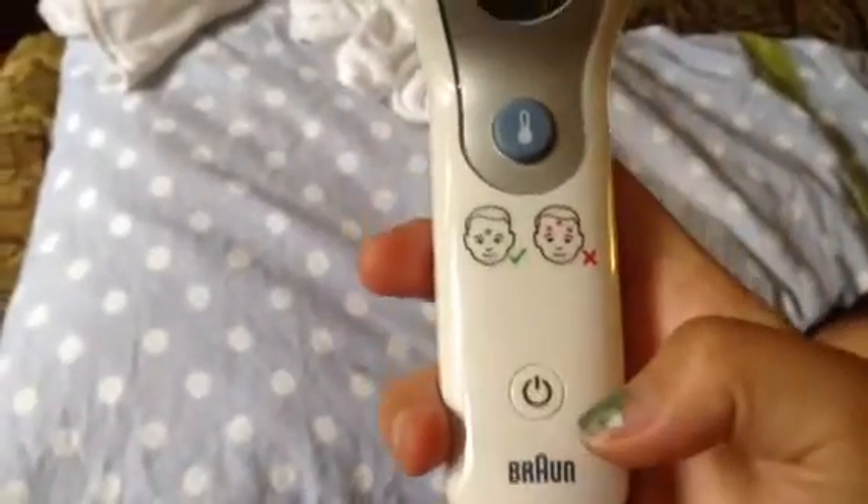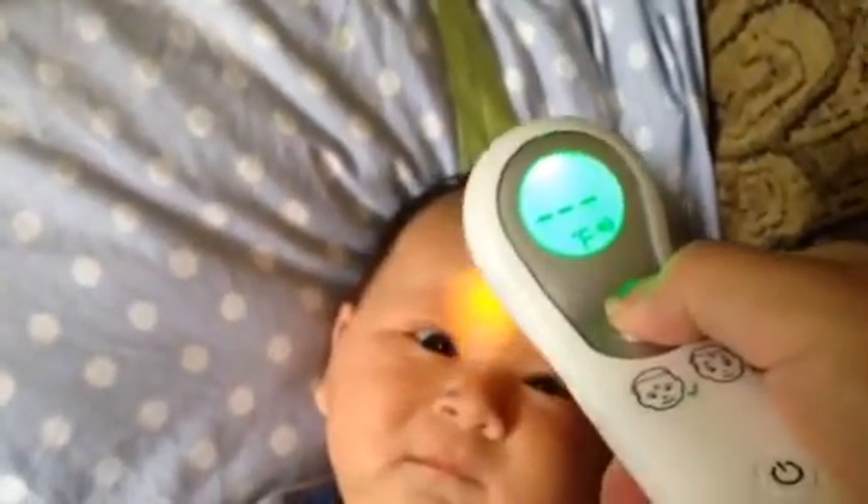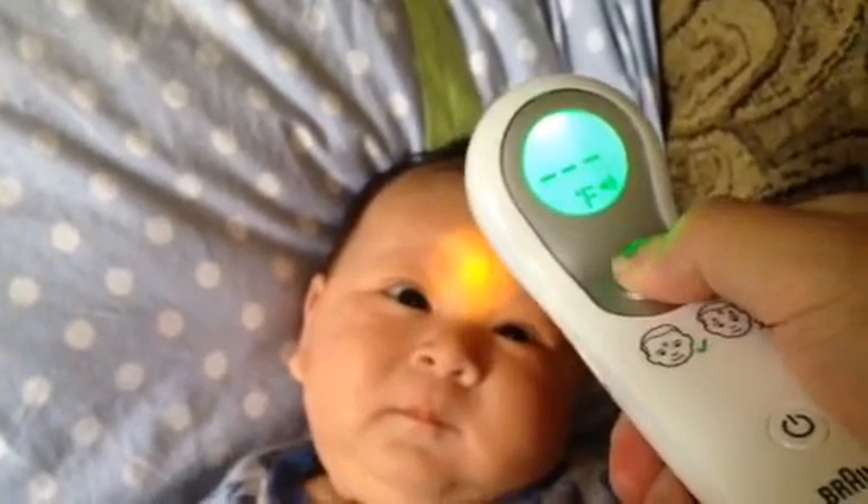This one has a button to make a sound or mute it, and then you turn it on and get a light that shows you where to point it. We are going to test it on him — he's just staring at the light.